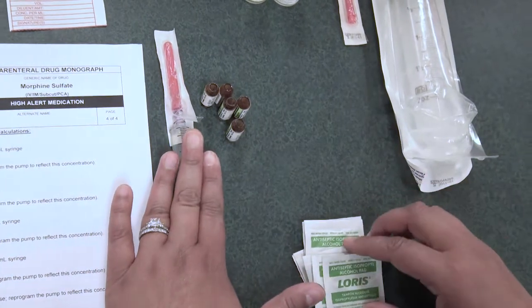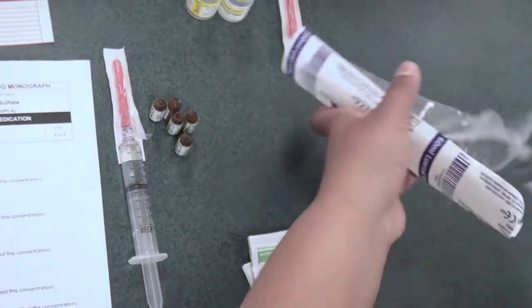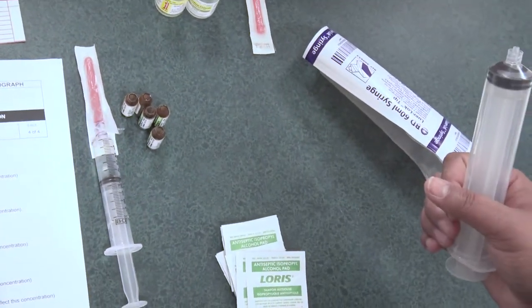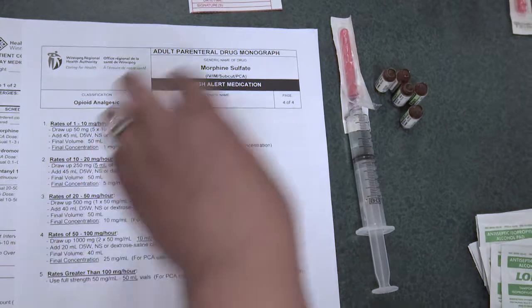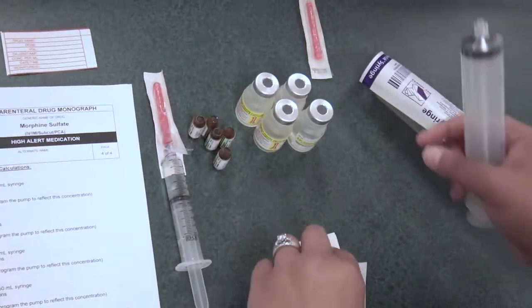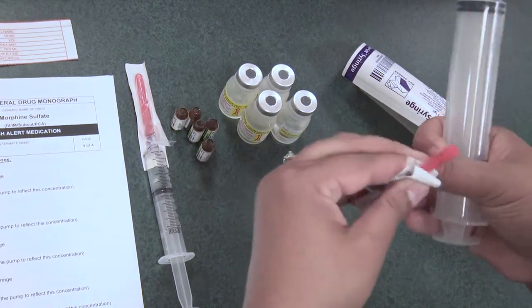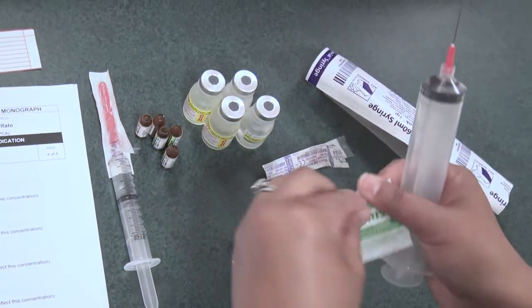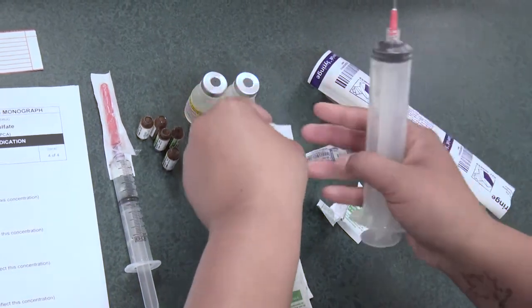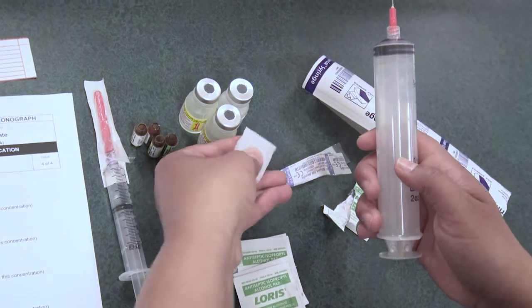I'm just going to leave this right here while I draw up my diluent. In the monograph, it says add 45 milliliters of normal saline, so that's what I'm going to do here. I'm going to put my blunt tip needle on, and clean for 30 seconds.